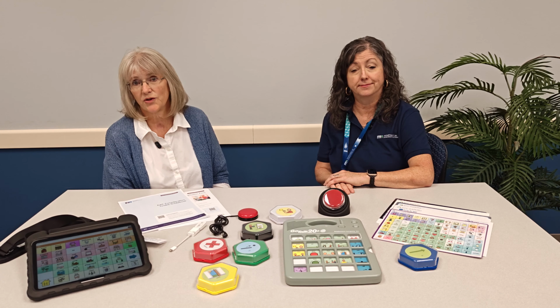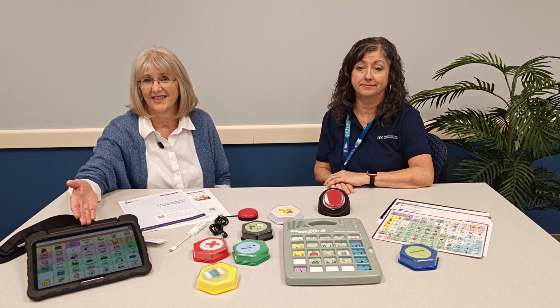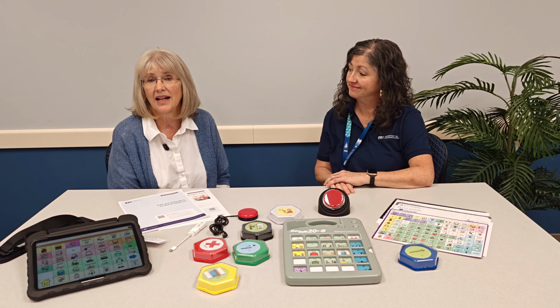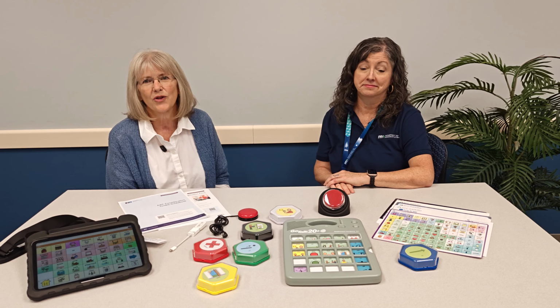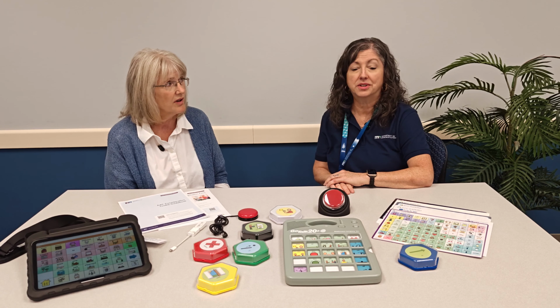Section 2 also walks you through important iPad setup features like turning on guided access to keep the student focused within an AAC app and locking the edit button to prevent accidental changes. You'll also want to help the student choose a voice that feels personal and natural.